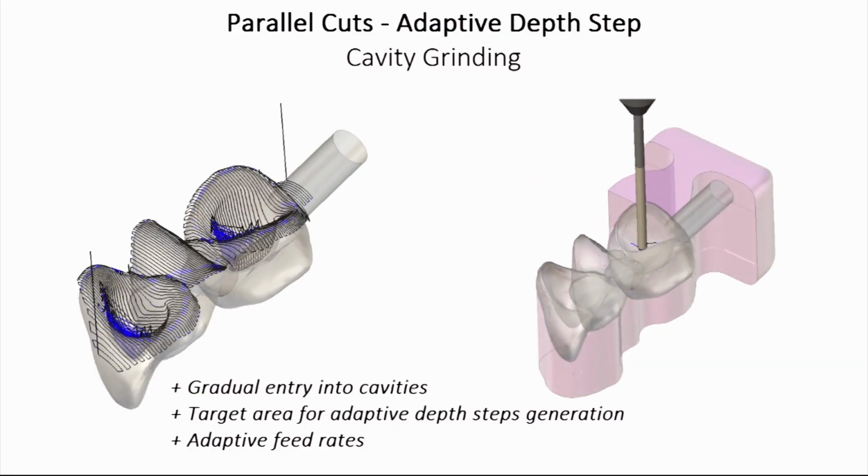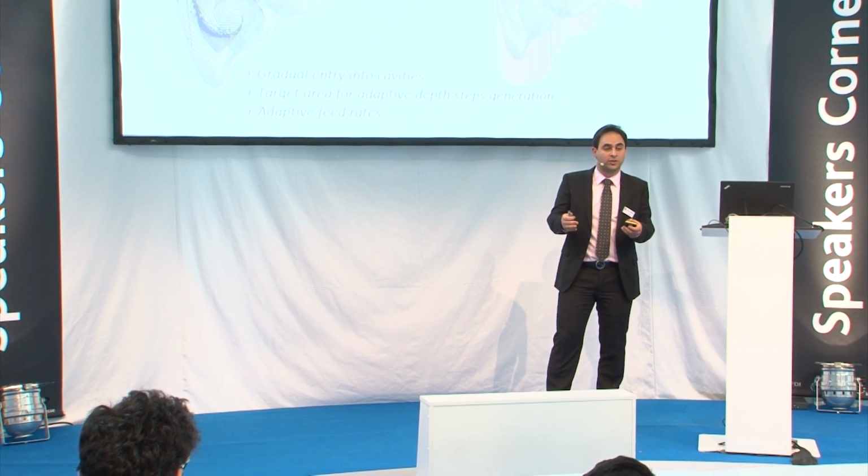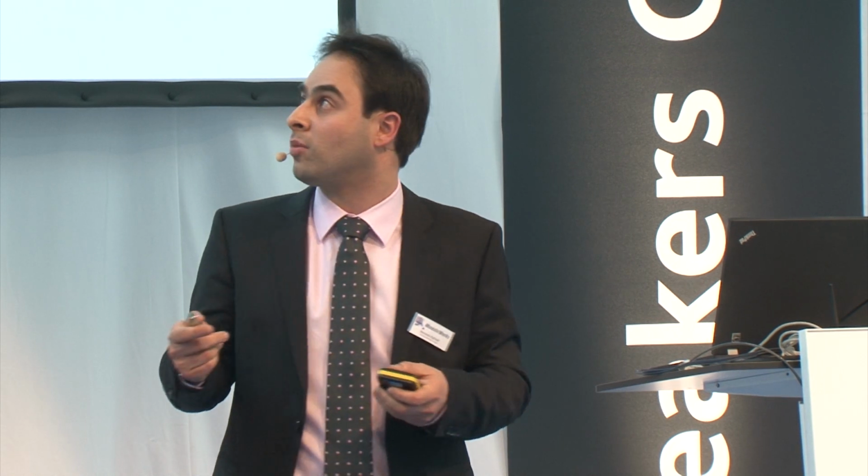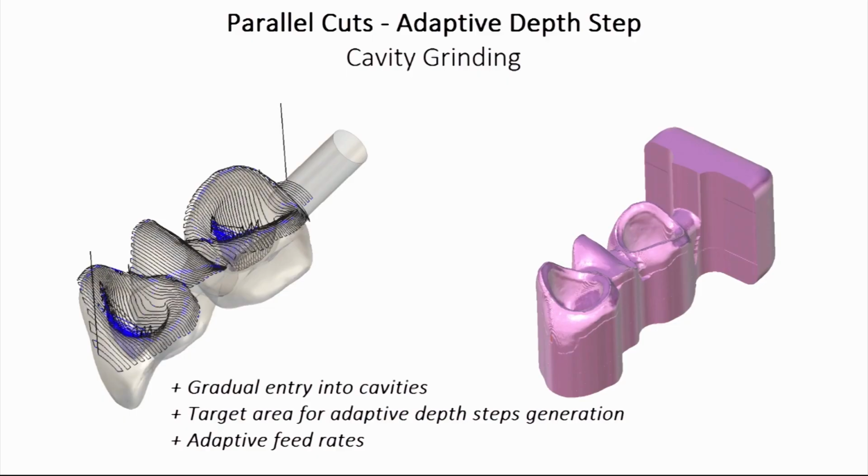This feature and the one before worked relatively stable, especially with bullnose. But the problem with them was that they were not appropriate for chairside market, where we need to be really fast. All of these intermediate slices or those spiral ramps create a lot of machining time.